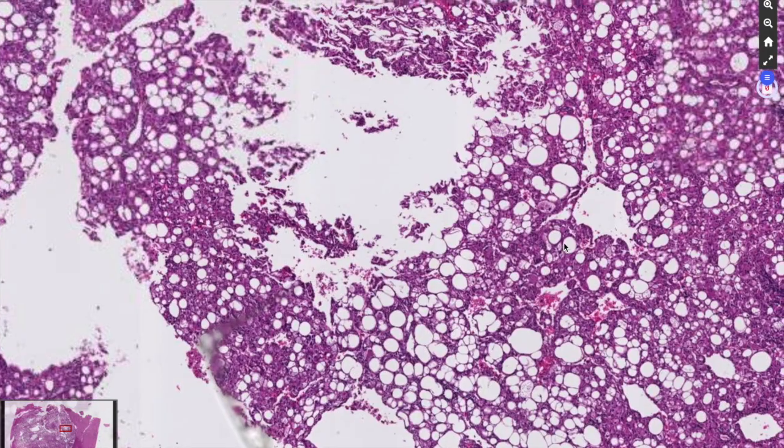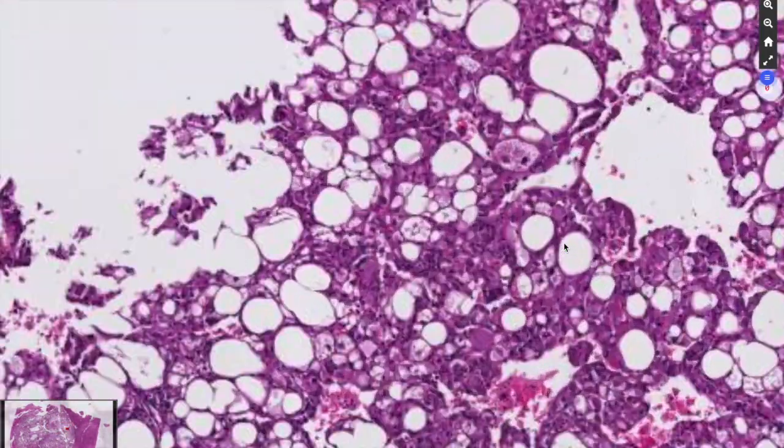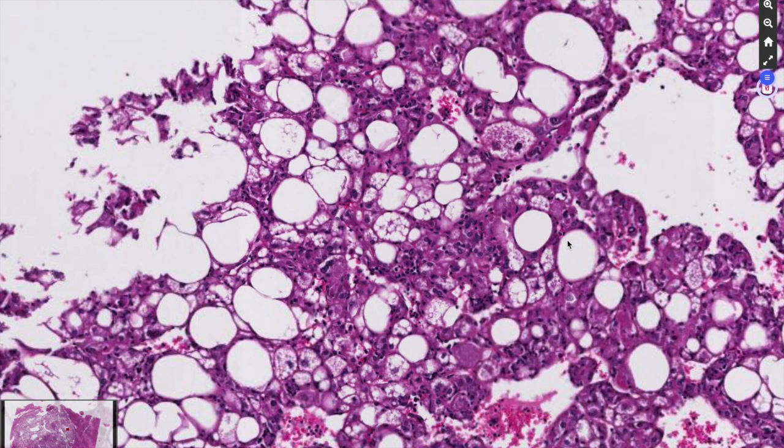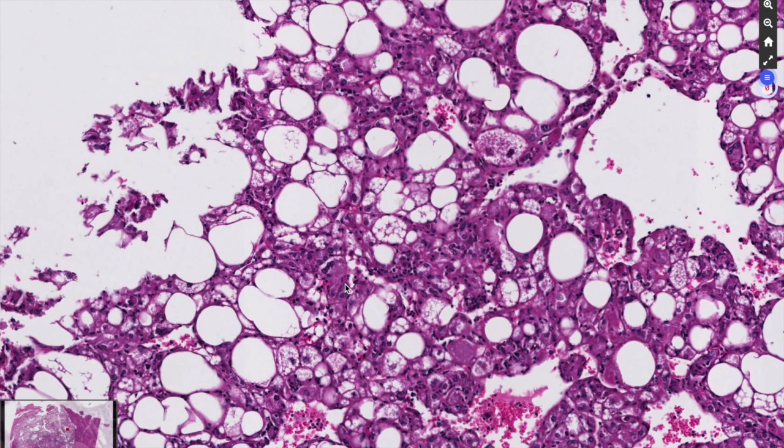You have these cells. Let's wait till it becomes clear. You have these cells, they look like hepatocytes, some steatotic, some with an eosinophilic cytoplasm. There seems to be a trabecular architecture.